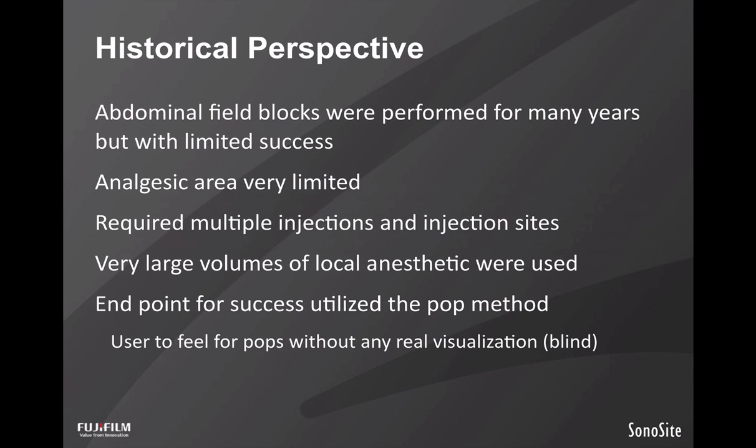So I wanted to start with a little bit of a historical perspective. Abdominal field blocks were performed for many years, but with limited success. And as a result, the analgesic area was very limited because the success was variable. It required multiple injections and injection sites.